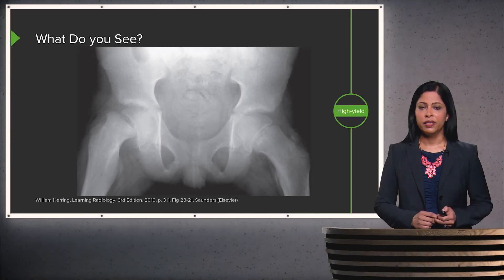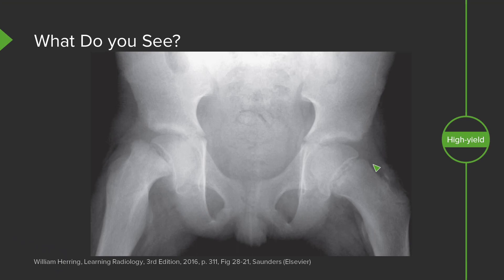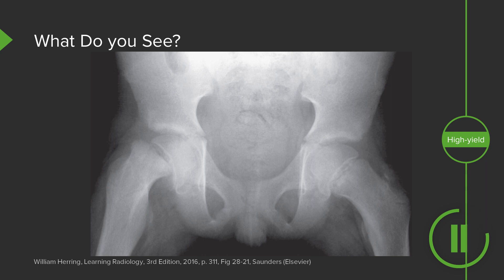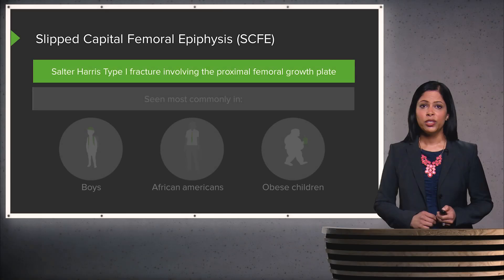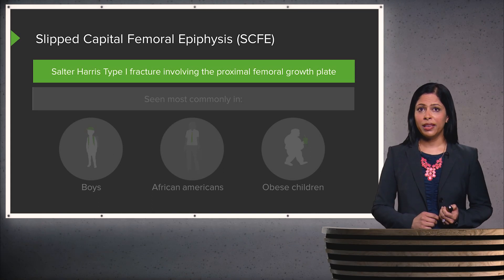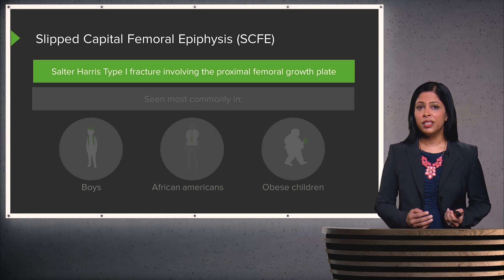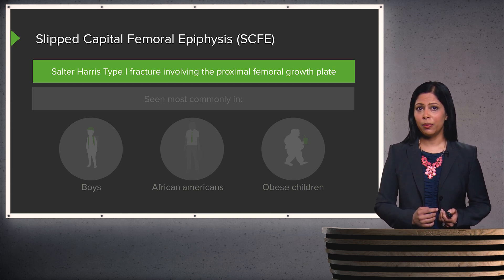This is an x-ray of the pelvis in a skeletally immature patient. You can see the growth plates are open on the hips here. So what is the abnormality? This is an example of slipped capital femoral epiphysis, or SCFE. This is a Salter-Harris type I fracture that involves the proximal femoral growth plate.